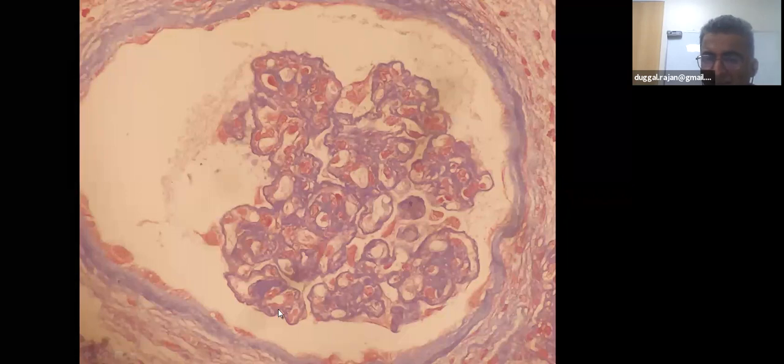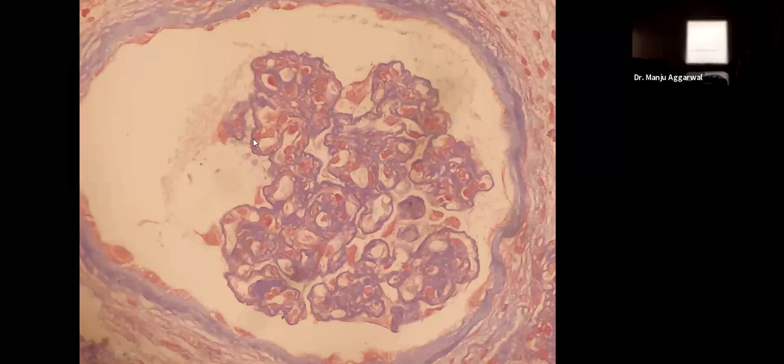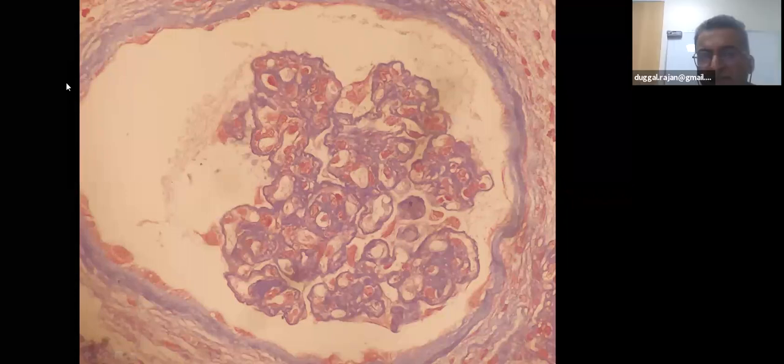We have to remember, as this is for pathologists, that whenever a glomerulus is ischemically wrinkled, it will show some duplication. So many times in transplant biopsies, if there are ischemically wrinkled glomeruli, they are interpreted as transplant glomerulopathy, which is not correct. You have to see if the glomerulus is showing expansion of the urinary space, which means it is an ischemically wrinkled glomerulus. You don't interpret duplication in these ischemically wrinkled glomeruli.